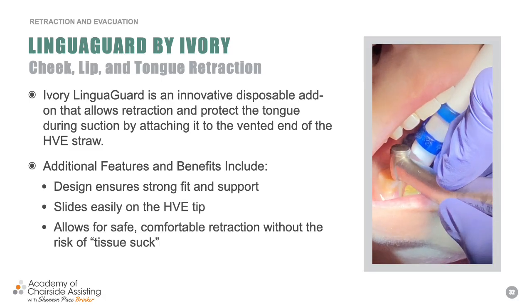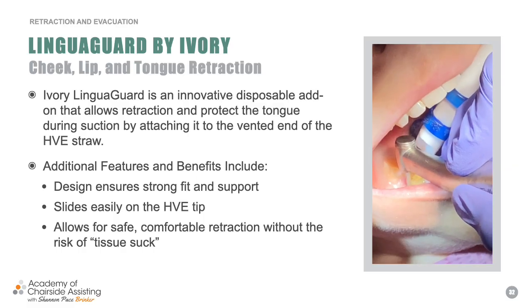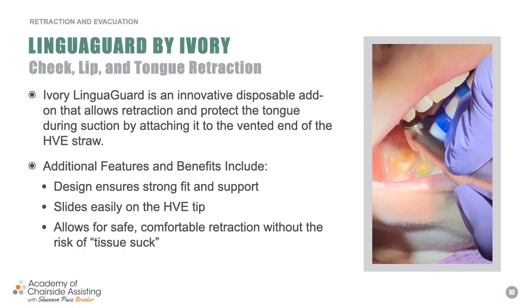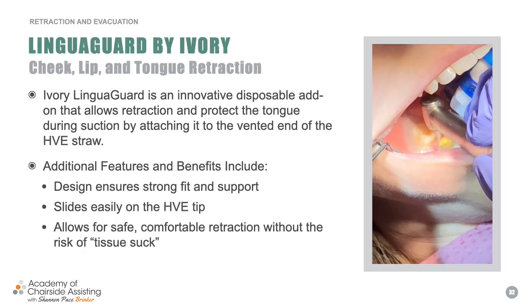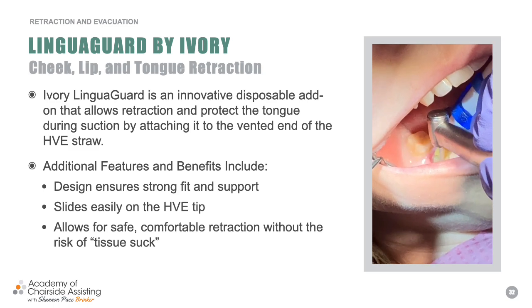It's a really nice little device because you see here I'm able to push the patient's tongue back and remove the saliva at the same time, especially if you work in a practice that doesn't allow you to have those other Safe Vac retracted HVE devices, right? Because we know that a lot of times price is something we have to really be considerate of. But again, these little devices are really nice.